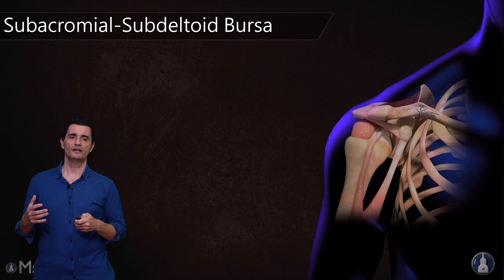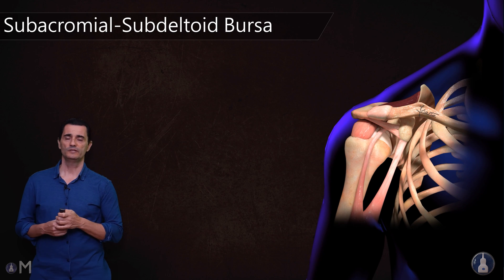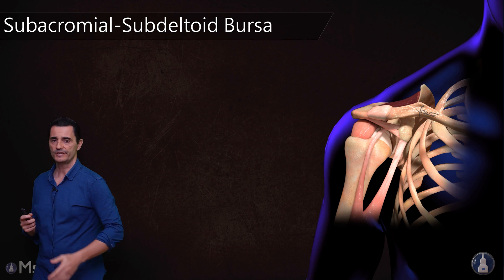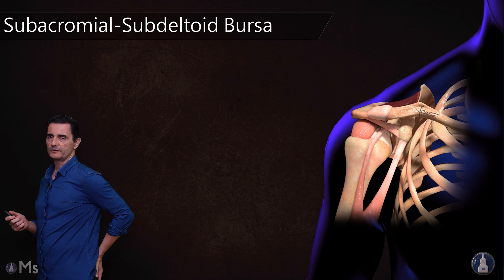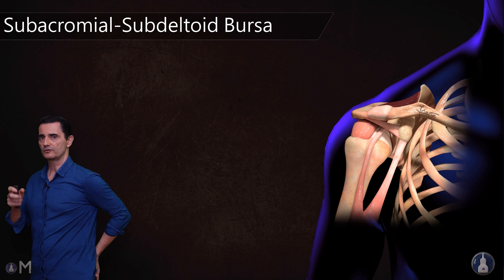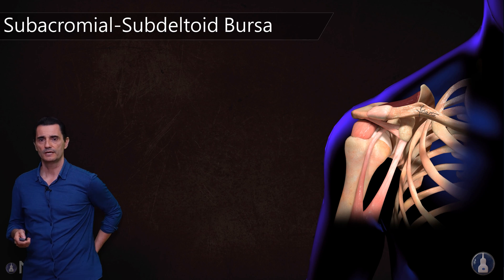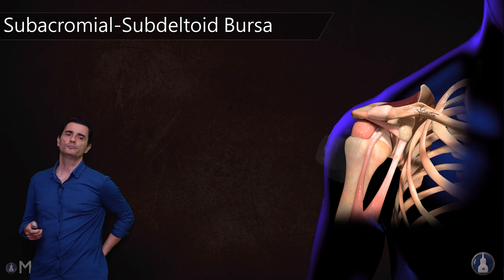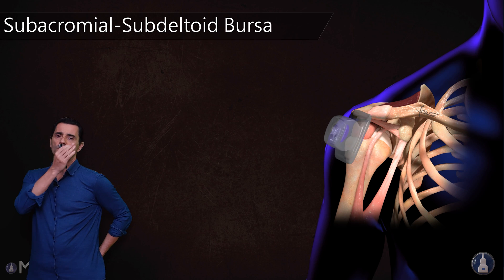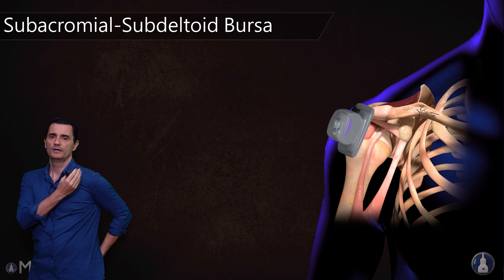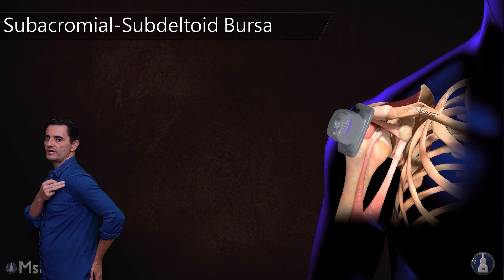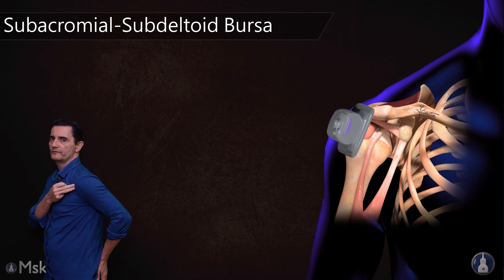To see this bursa with ultrasound, we will ask the patient to put the arm in the modified cross position. We will put the probe almost vertical, slightly rotated over the most anterior part of the shoulder.